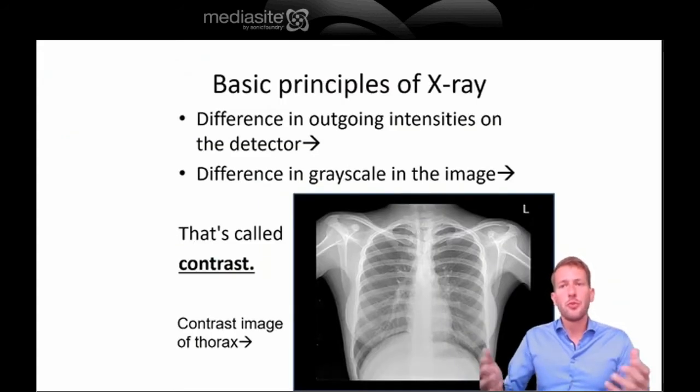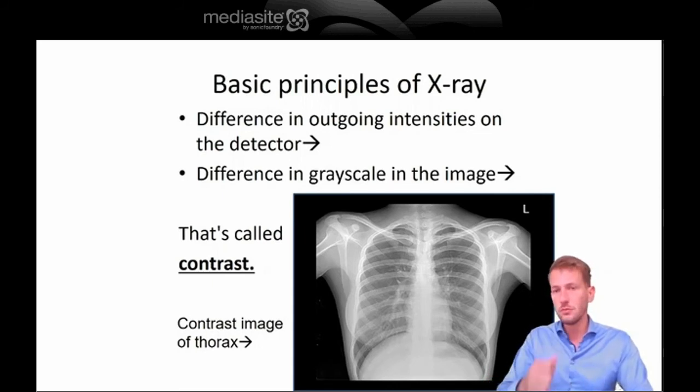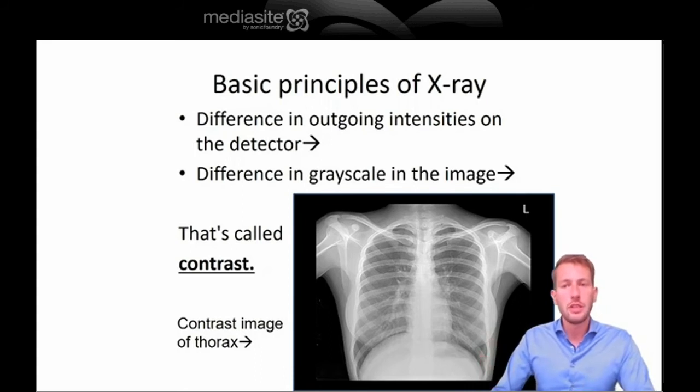So what is contrast? As you can see on this slide, we define contrast as the difference in grayscale in the image, which is caused by the difference in outgoing intensities on the detector. The better you can distinguish different kinds of tissue with different attenuation properties, the higher the contrast.